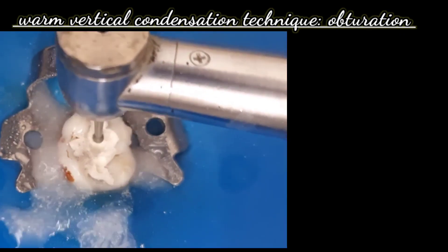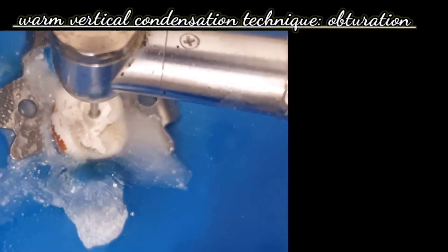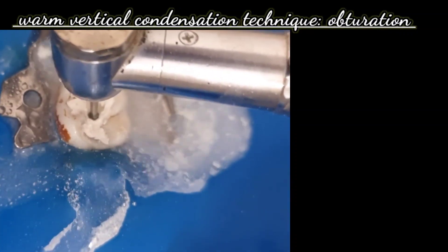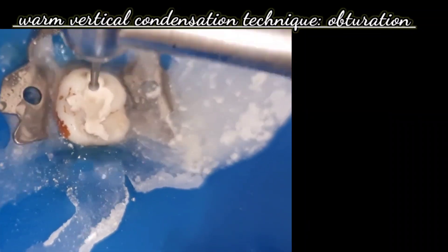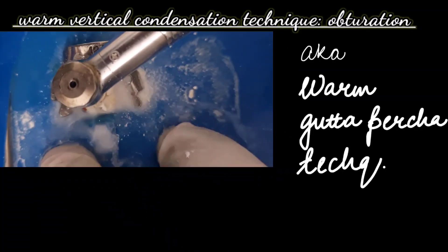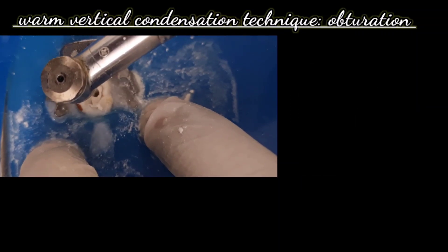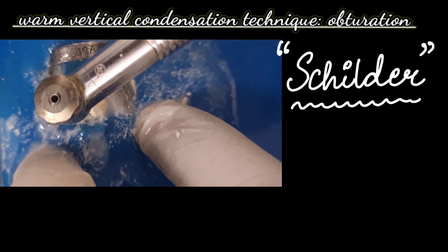Welcome back. In this video we are going to demonstrate the warm vertical condensation technique of obturation. We have already covered the access cavity preparation and biomechanical preparation. This video is a demonstration of warm vertical condensation technique, also known as the warm gutta-percha technique of filling root canals. This technique was introduced by Schilder with the objective of filling the lateral canals, accessory canals, as well as the main root canal.